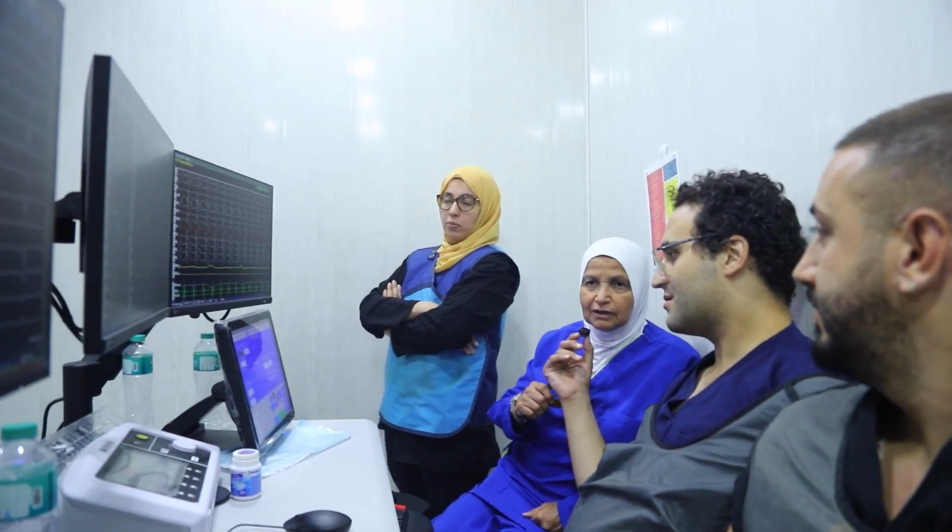This is the first case of 3D with this brilliant team, Dr. Bayoumi, Wali Drojdi, Ahmed Rasasi, Salih Sawaf. This is the first case with Insight X. We are proud that the government is supplying this high-tech technology to insured patients and to Nafa Dawla patients.